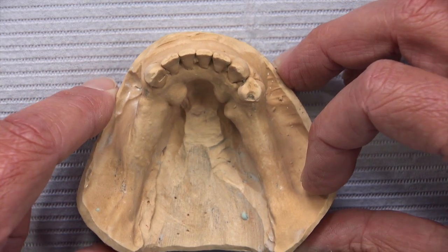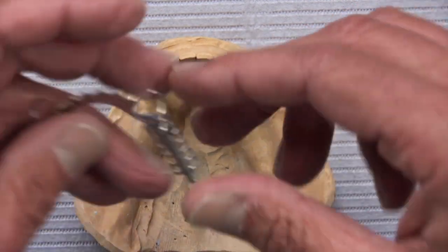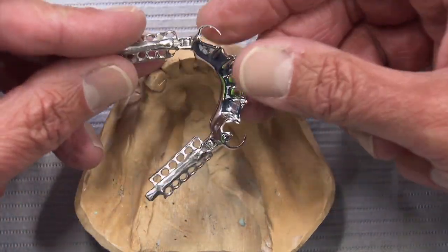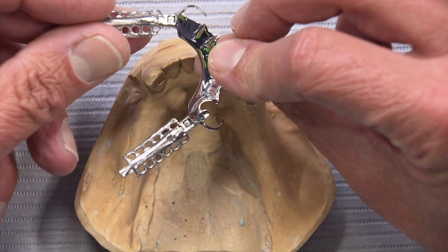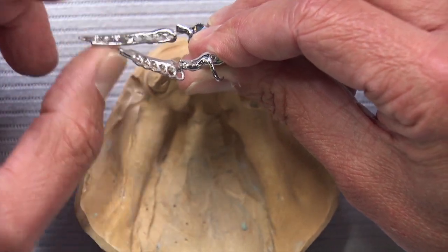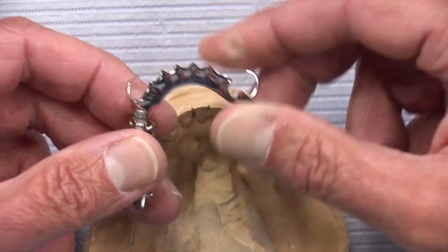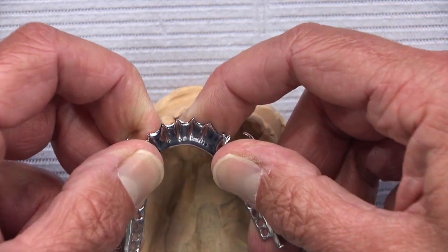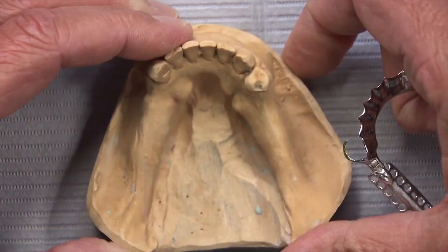With that hinge we're able to place a circumferential clasp around the cuspid. If you haven't seen a distal extension hinge yet, this is what the framework actually looks like — and that is the hinge. You can see it on both sides. The hinge simply provides a stress breaker between the saddles and the major connector.